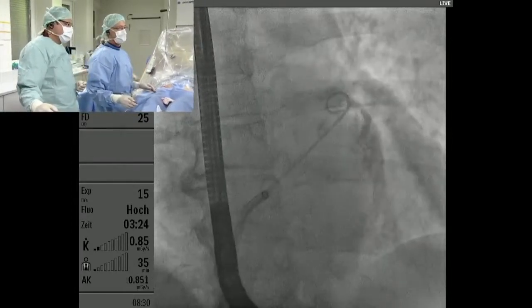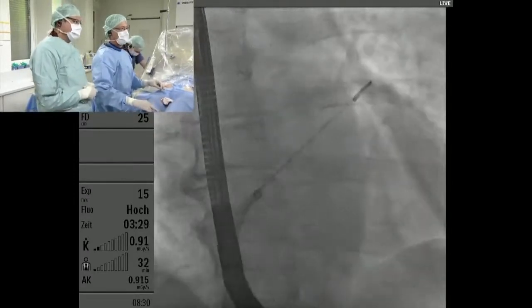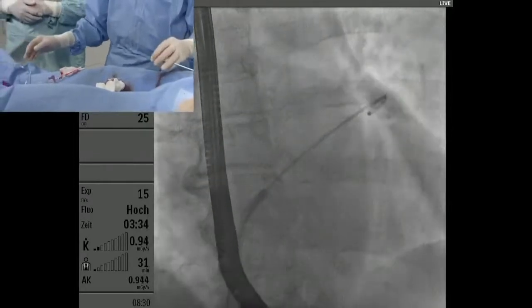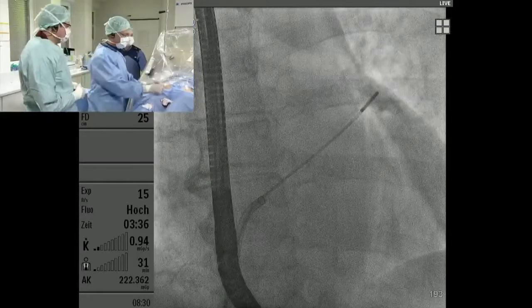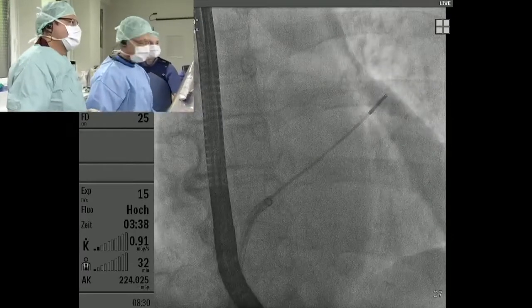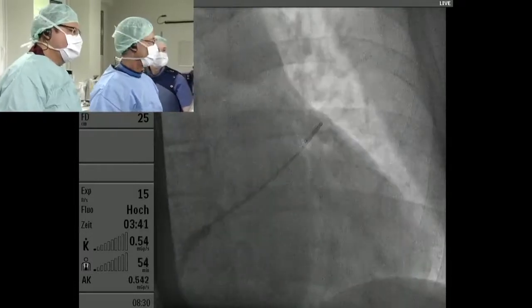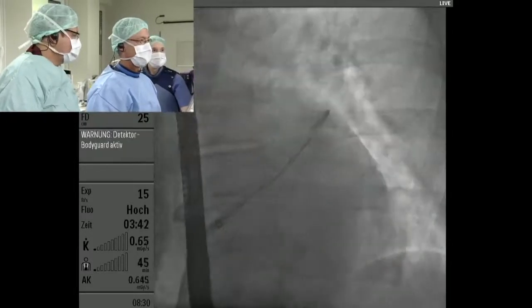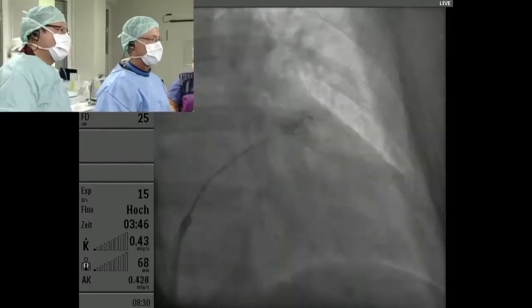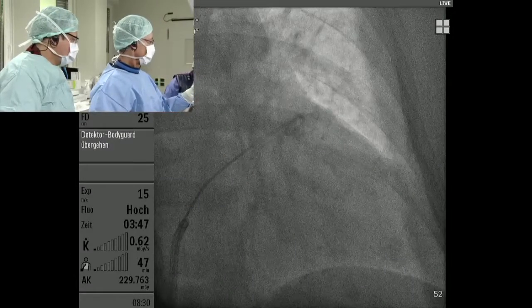Roland, do you have arterial access also? Invasive arterial access? I don't understand your question. When you are performing left atrial appendage closure, yes. Do you have arterial access also? No. Okay. I think the difference here is that it's not under general anesthesia, right? So if you do the TEE or TOE under general anesthesia, you have to have that A-line by definition. What do you mean by definition? I mean the anesthesia society has that as a requirement. Oh, really? Yes. Interesting.